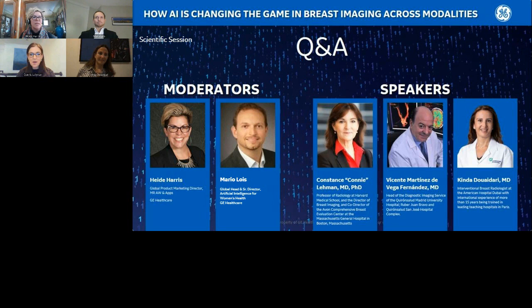We are. So we have a model in place that, as I mentioned, assesses breast density, and that's something we trained, and we did a lot of research after clinical implementation, the acceptance by the radiologist, and the predictive capability. We also have running on every mammogram that we obtain, and we do about 50,000 mammograms a year in our Mass General system, future breast cancer risk scores. So a risk score at 1 year, 4 years, 5 years into the future. When we all needed to shut down our screening during the COVID highest level of crisis, we were then asked to bring back those patients at increased risk.